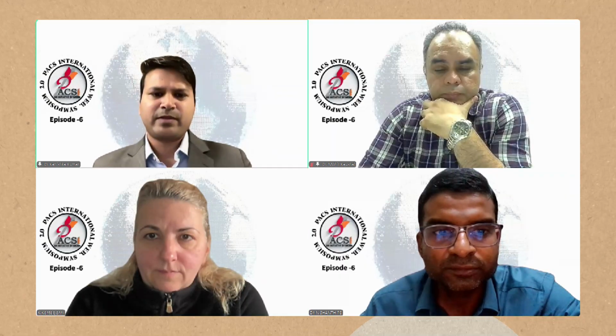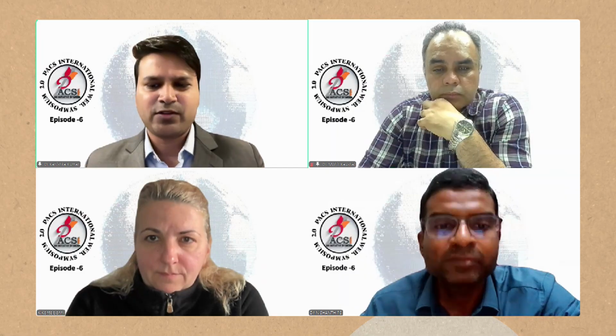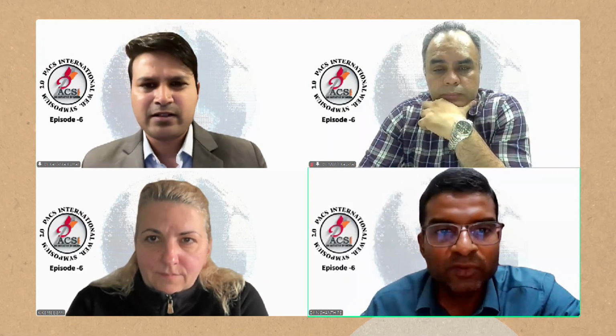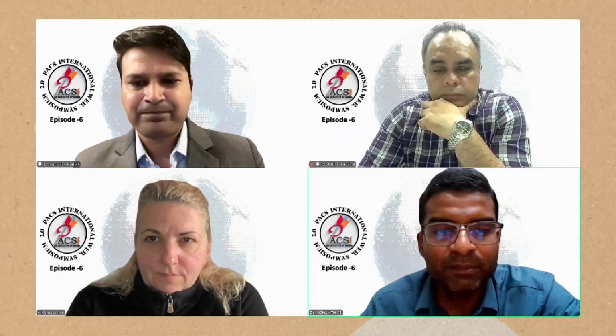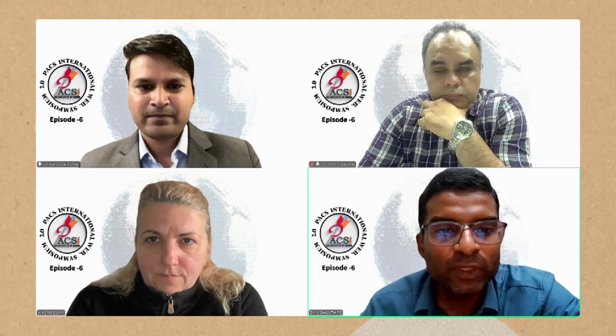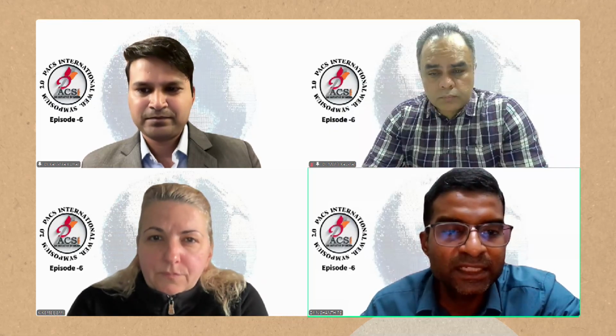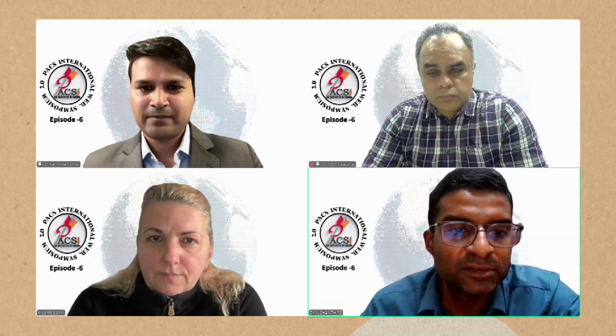Okay, I think they must be asking about when the patient is very hypoxic and you cannot do the bronchoscopy, then you can just put a sterile catheter. Yeah, I think the question might be that way. With a mini BAL, will you be able to aspirate the contents? Because while doing a mini BAL, you do not know where you are taking the content from. It's just a blind procedure.